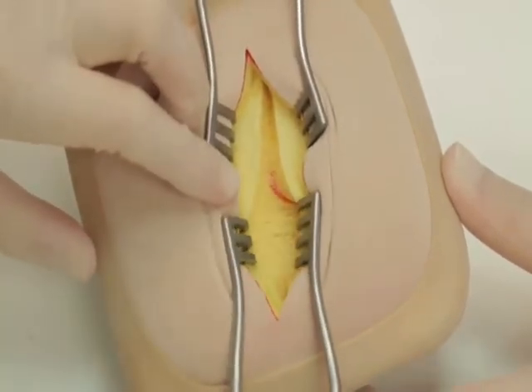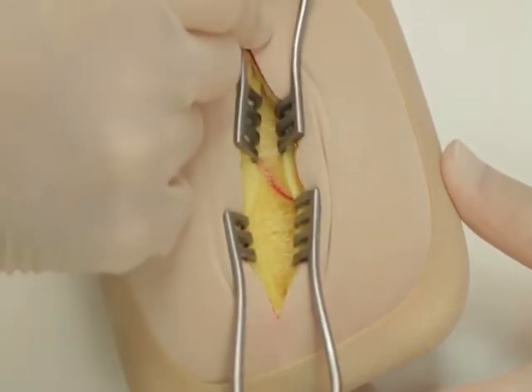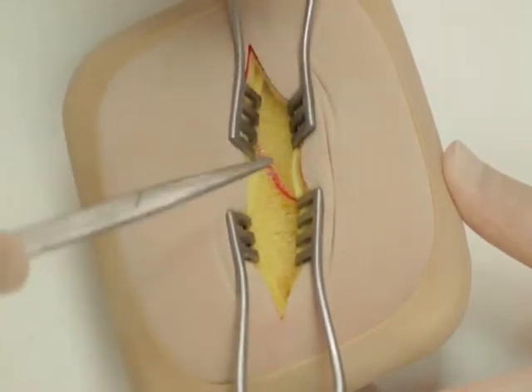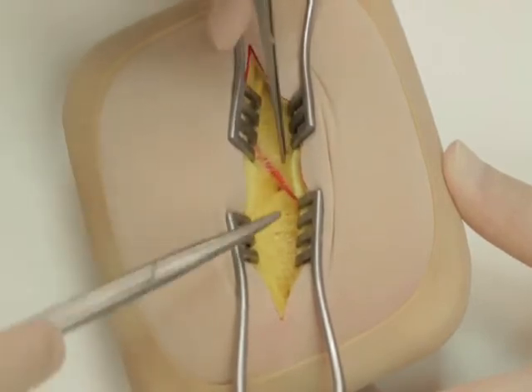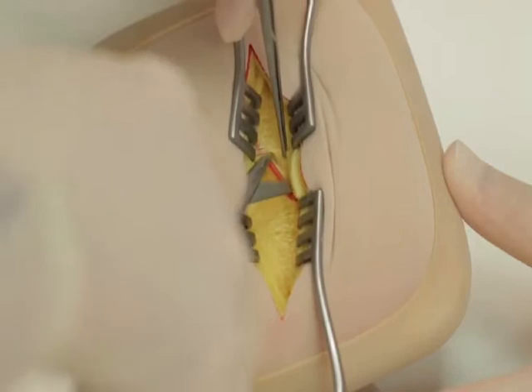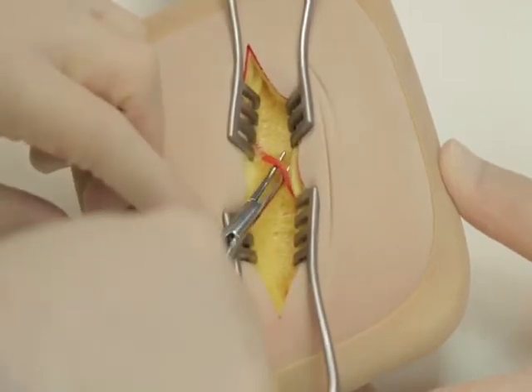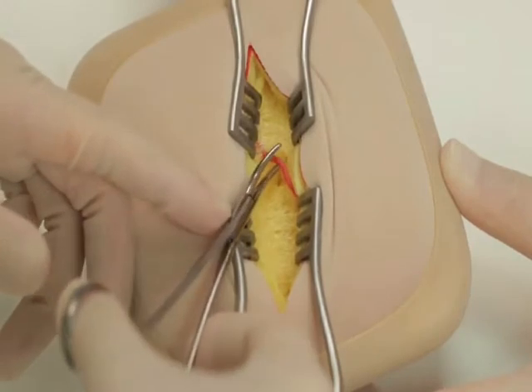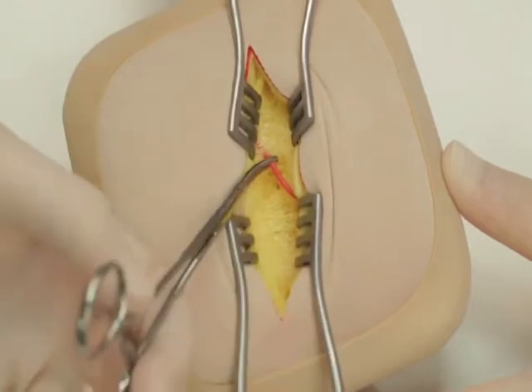The self-retaining retractors should be repositioned to give a better view. Blood vessels crossing the operative field should be ligated with a suitable material such as 3-0 Vicryl. Spreading dissecting scissors along the line of the blood vessel is less likely to damage it.